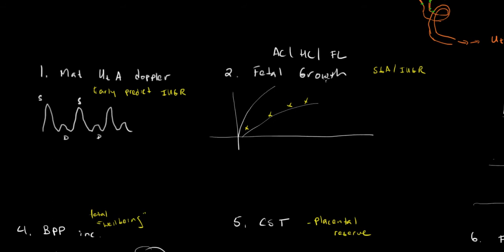And I'll also talk about things that you monitor for looking for chronic growth problems such as IUGR or intrauterine growth restriction, but as well as things that monitor for more acute events such as acute insufficiency to the fetus via the placenta that could cause anoxia or ischemia or acidosis. So I'm conflating a lot of things together.